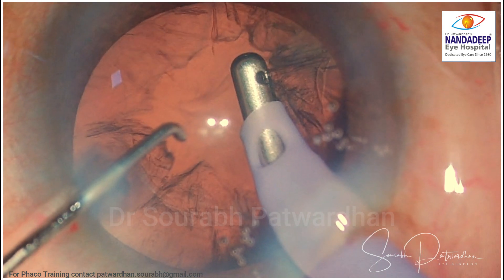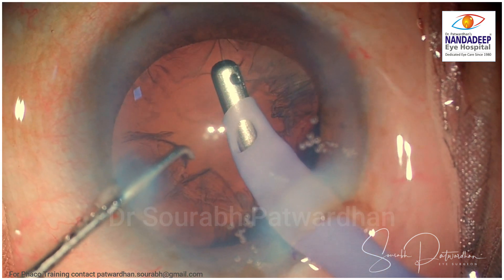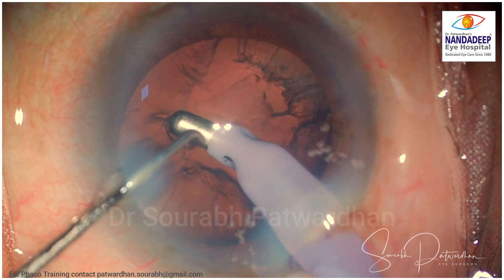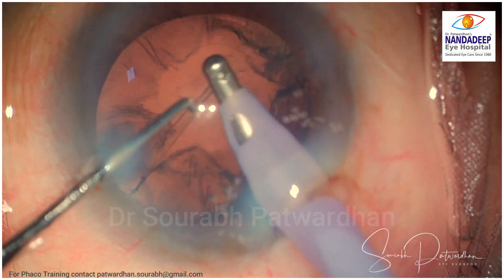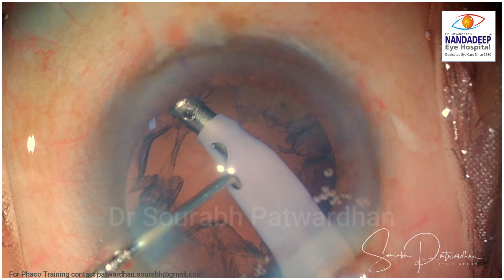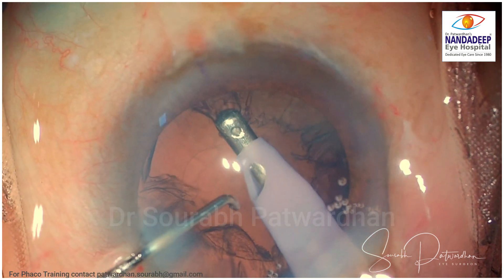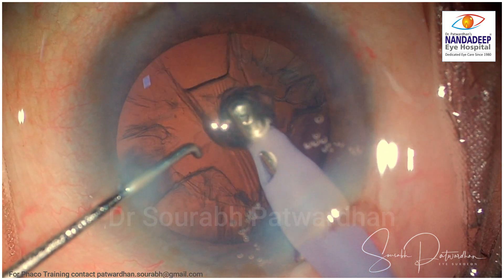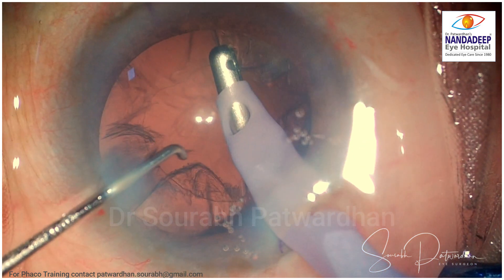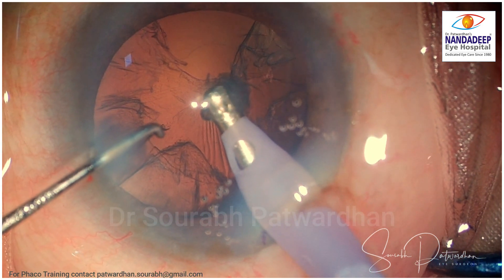That's why the posterior capsule is a bit lax in the post-equatorial area, and that's what is getting pulled in. So you have to be very careful again in this case. You can see on the other side the same thing is happening. I am going to go ahead on the other side of the incision and watch if the zonules are good in that area. Good thing is that the anterior zonular support is good — the anterior capsule is stable — and we want to maintain that during cortex aspiration. This area has very good posterior zonular support as well, giving good counter traction for the cortex removal like in a normal case.